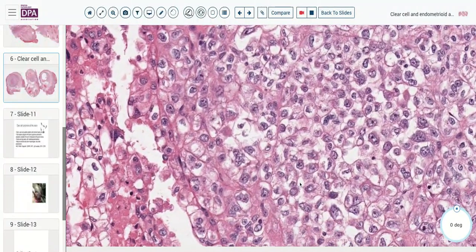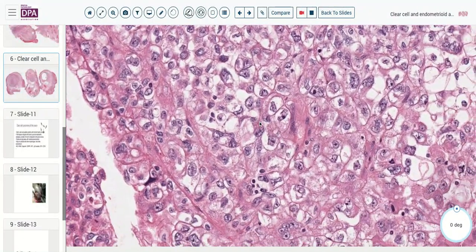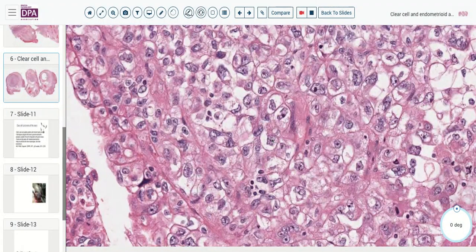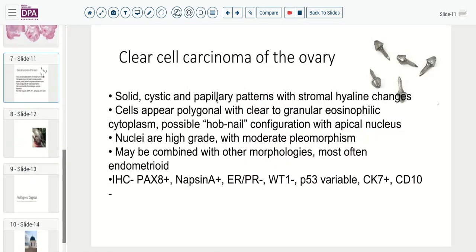So this is a nice example showing several different sections of a clear cell carcinoma, in this case arising in the ovary, though these tumors can also occur in the endometrium and occasionally in the cervix. Clear cell carcinoma of the ovary characteristically shows either solid, cystic, or papillary patterns, and this stromal hyaline change is quite remarkable. The cells tend to be polygonal with clear cytoplasm, maybe granular eosinophilic cytoplasm, and this hobnail configuration.